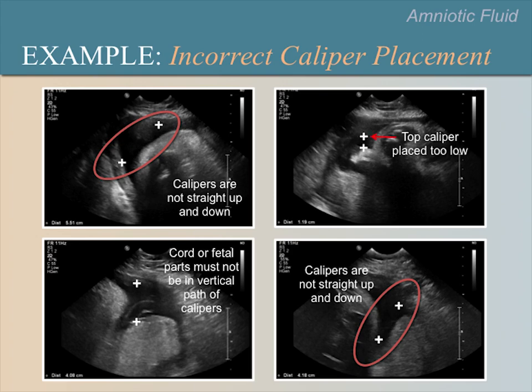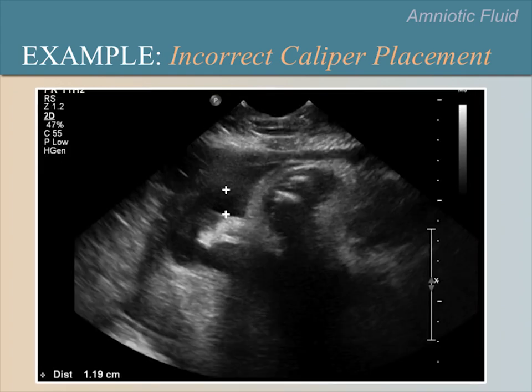We have now enlarged the image. Look just anterior to the top caliper, and you will see a hazy or fuzzy cloud that blurs the true edge of the uterus. Here we have outlined this cloud, which is an artifact and is not really there. This is called a near-field artifact and can be seen sometimes in the near fields of the image because the ultrasound echoes bounce and scatter in the body wall of the patient.